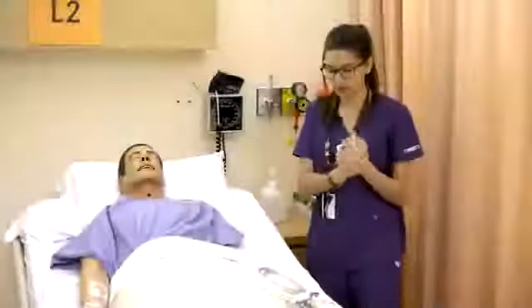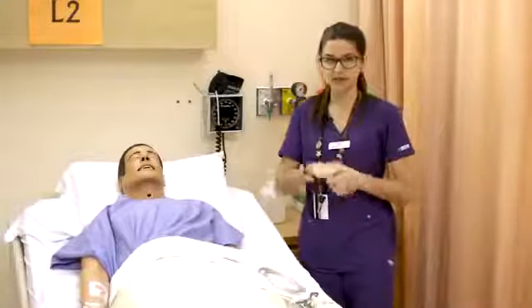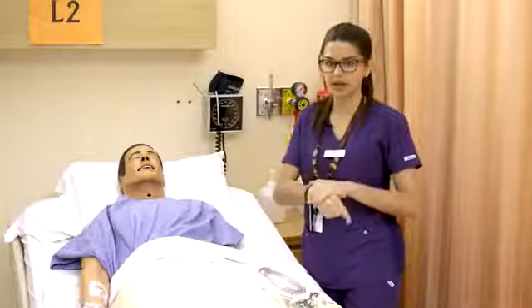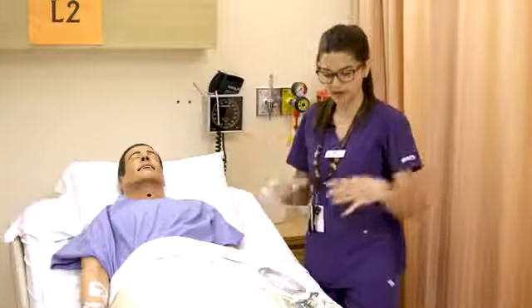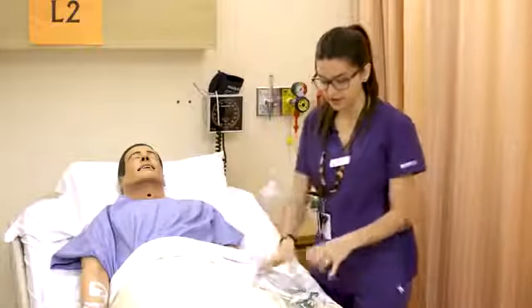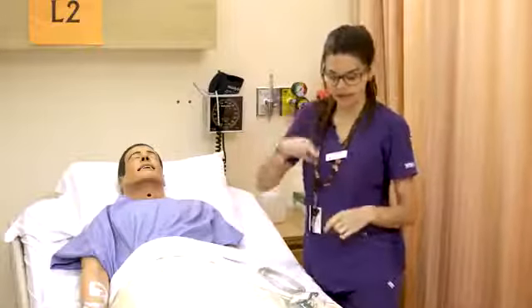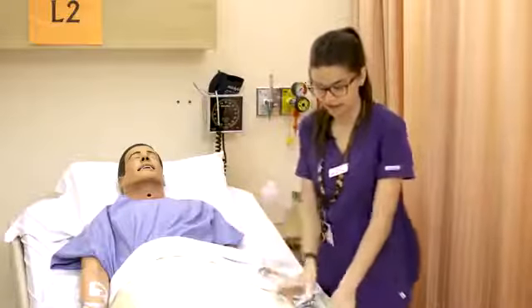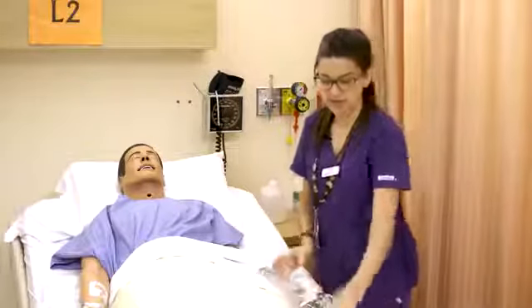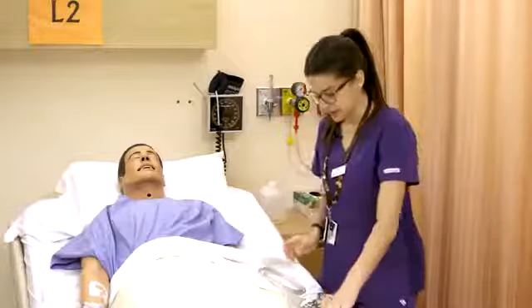So now we'll go over the simple face mask, as well as the non-rebreathe and modified rebreathe, because they all come together now in a single package. They come in that clear package with the label inside. You'll see you get a mask, a reservoir bag, valves, and a little connector piece.